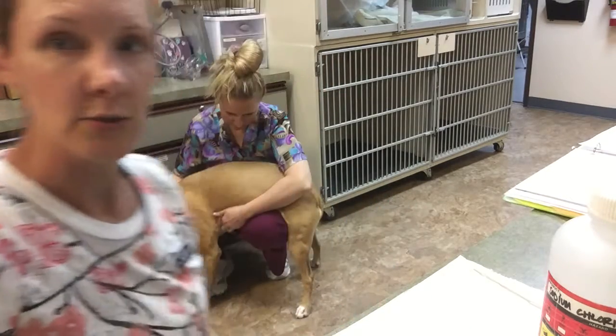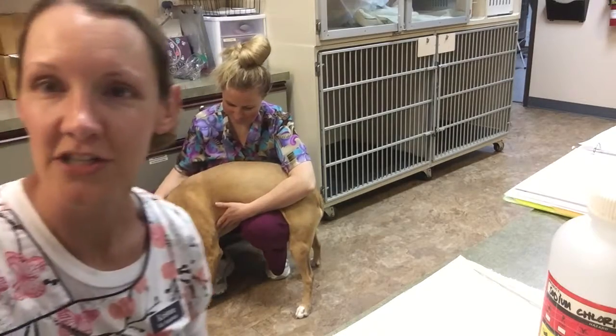Hi, my name is Kristen Jones. This is task 13, vaginal smear and cytology. I'm going to be using Lua today. There's Lua. She's our patient.